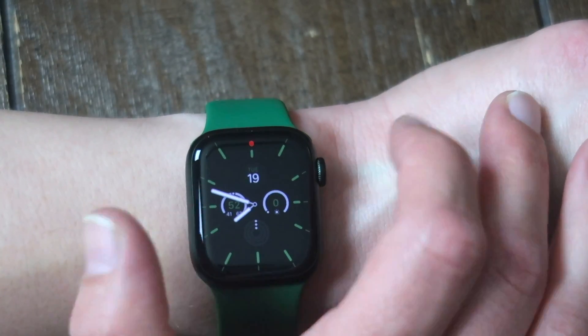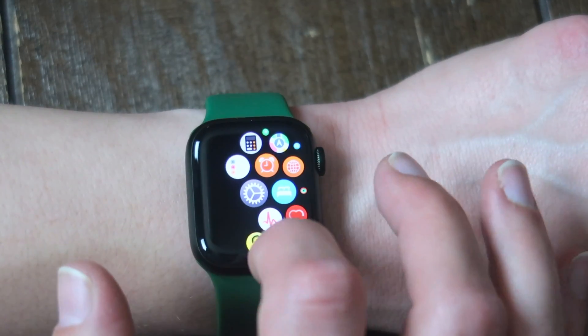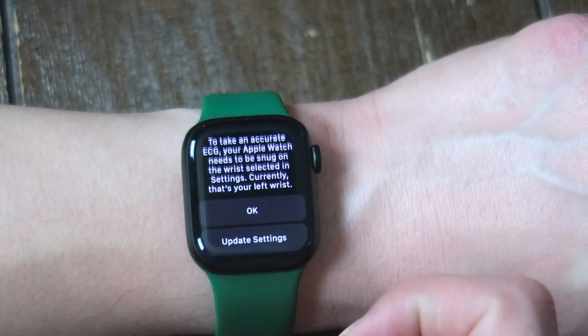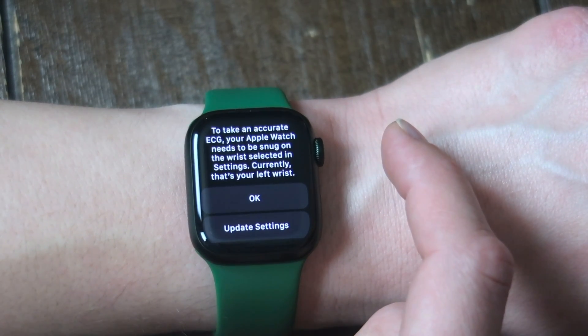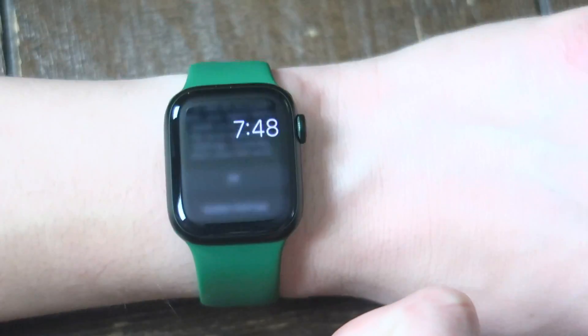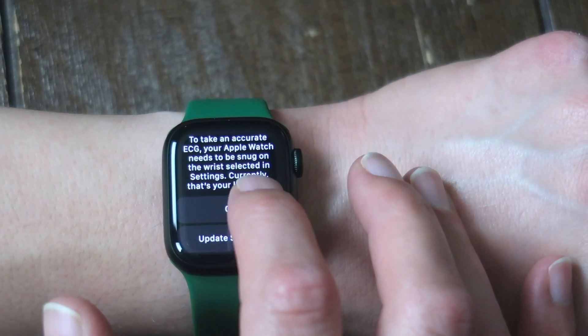I am here on the Apple Watch. What you're going to do is hit the home button. You're going to scroll until you find that weird white thing with the squiggly heartbeat. Click on that, and it's going to tell you that to take an accurate ECG, your Apple Watch needs to be snug on your wrist, selected in the current settings. Currently that is your left wrist, so I'm on my left wrist. You can update your settings if it's wrong, but right now I'm going to hit okay.